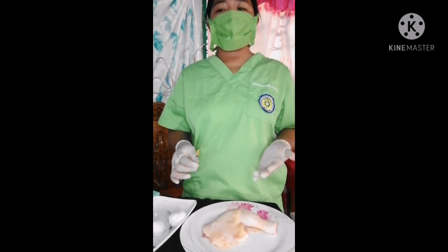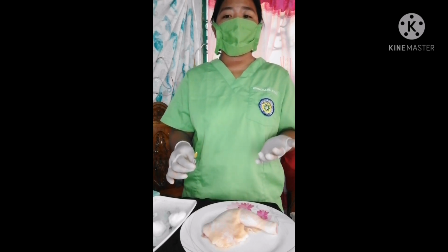Do not massage the area after removing the needle. Tell the patient not to rub or scratch the site. If necessary, gently blot the site with a dry gauze square. Do not apply pressure or rub the site.